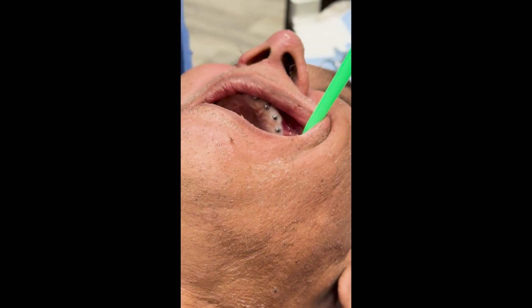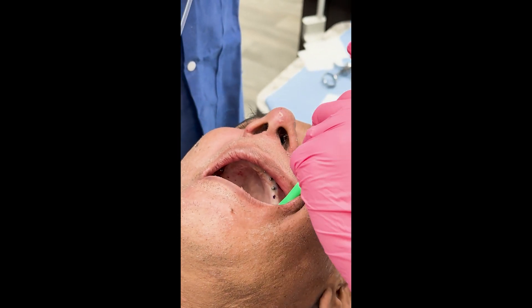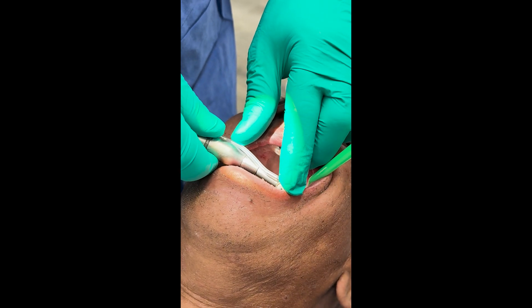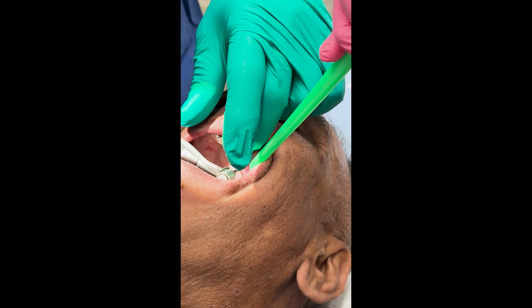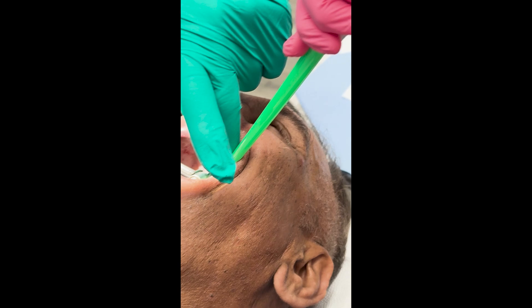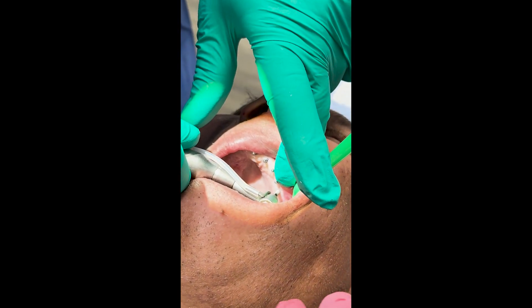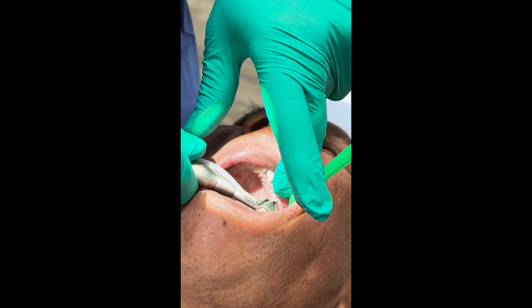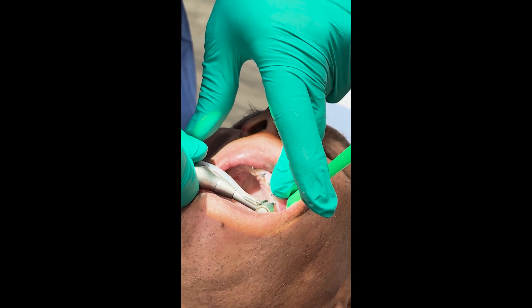And the last one — the bone's a little softer on this upper left side, but we're still getting decent torque. I can feel it in my handpiece. We're probably at about 25 to 30 newton centimeters, so we should be fine. And the last one's got torque — that's good.